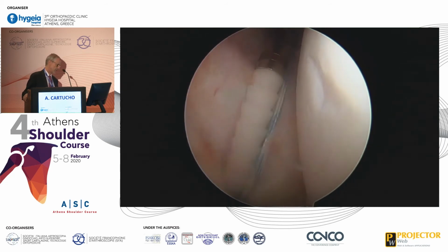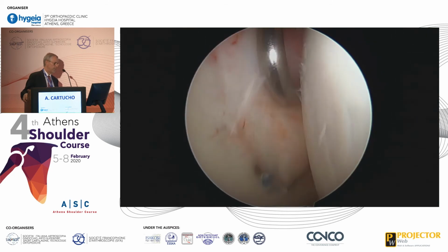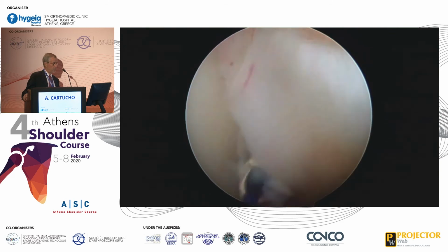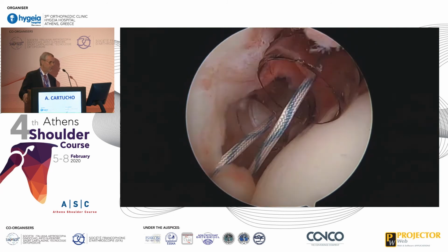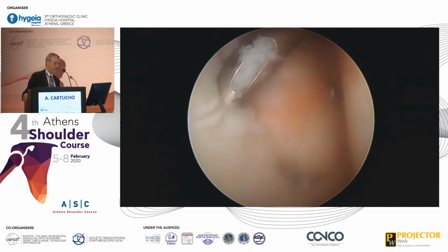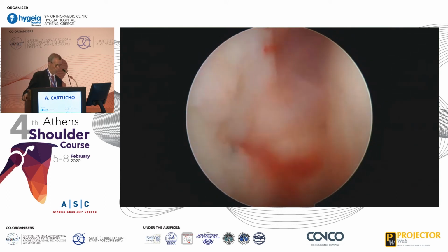Here, those devices have the advantage of not having knots in the front of the shoulder, and maybe being less aggressive to the head of the shoulder. Then we'll go with as many anchors as needed. I think if it is 2 that is needed, it's 2. If it's 3, it's 3. If it's 4, it's 4. So I don't really believe that you definitely have to have at least 3 anchors. I think it depends on the type of lesion it is, and the way of the procedure that you need to do in order to have a good healing of your labrum.